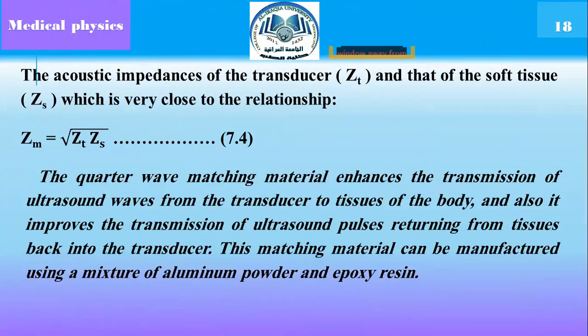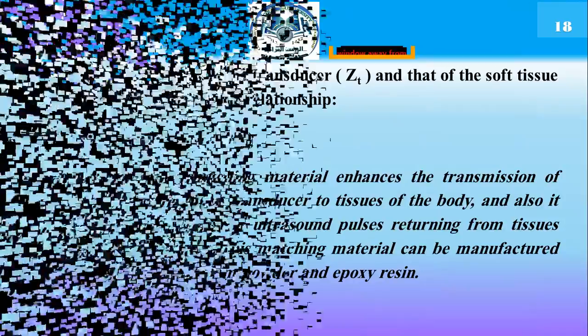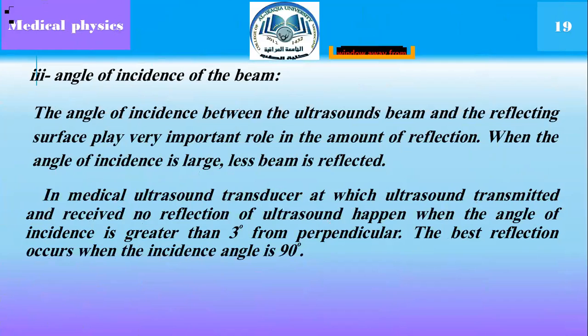Angle of incidence of the beam. The angle of incidence between the ultrasound beam and the reflecting surface plays a very important role in the amount of reflection.